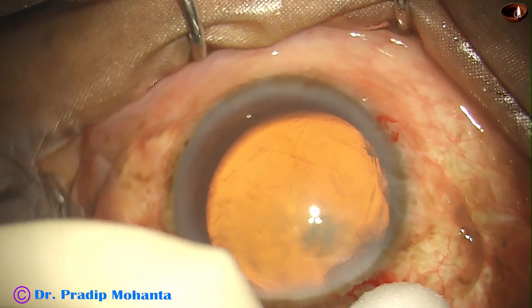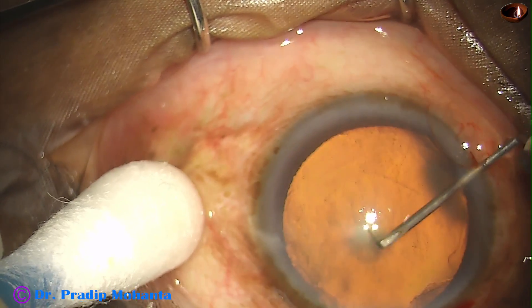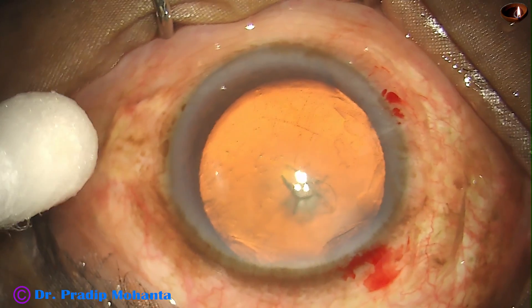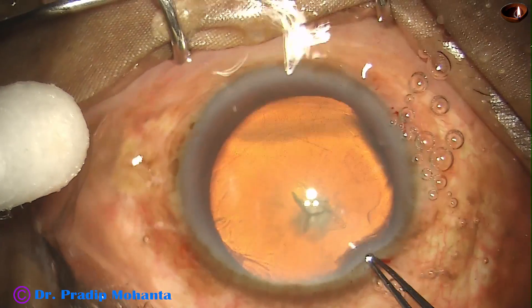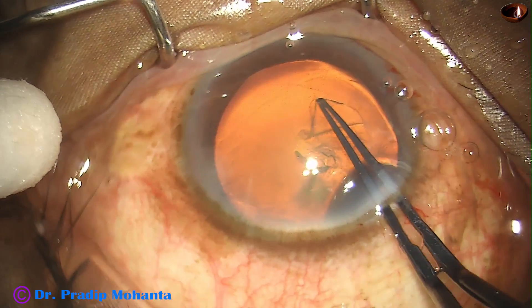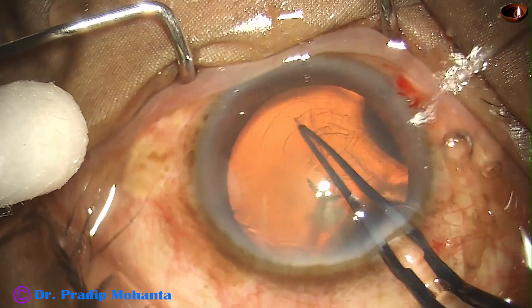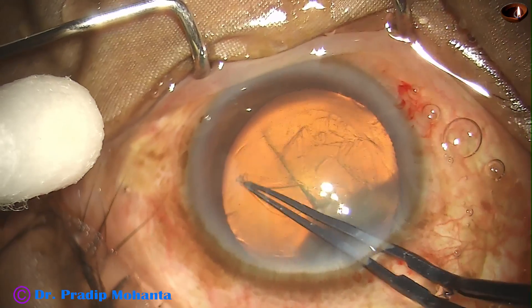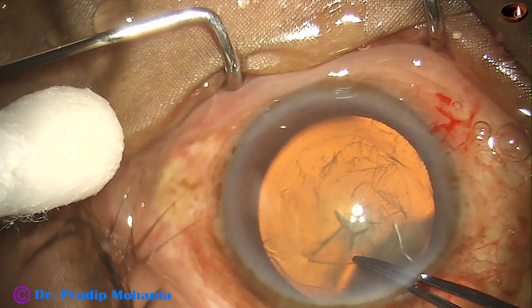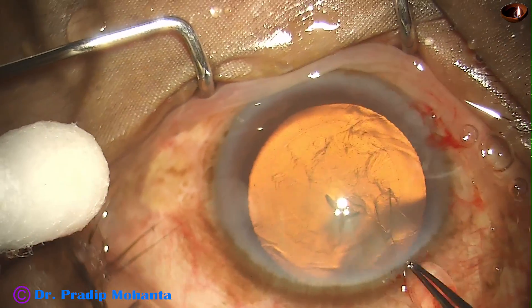These paracentesis incisions are about 2 o'clock and 5 hours away from the main wound. Now a 26-gauge bent needle has been used to incise the capsule. Now I take the utrata forceps, hold the capsular tag, go anticlockwise, remain at a certain distance away from the margin of the pupil, go all around and complete the continuous curvilinear capsulorhexis.